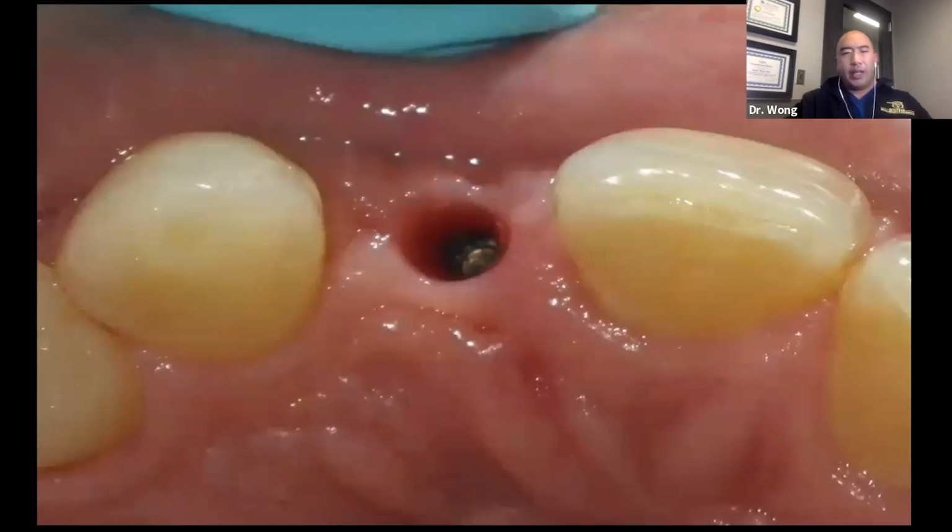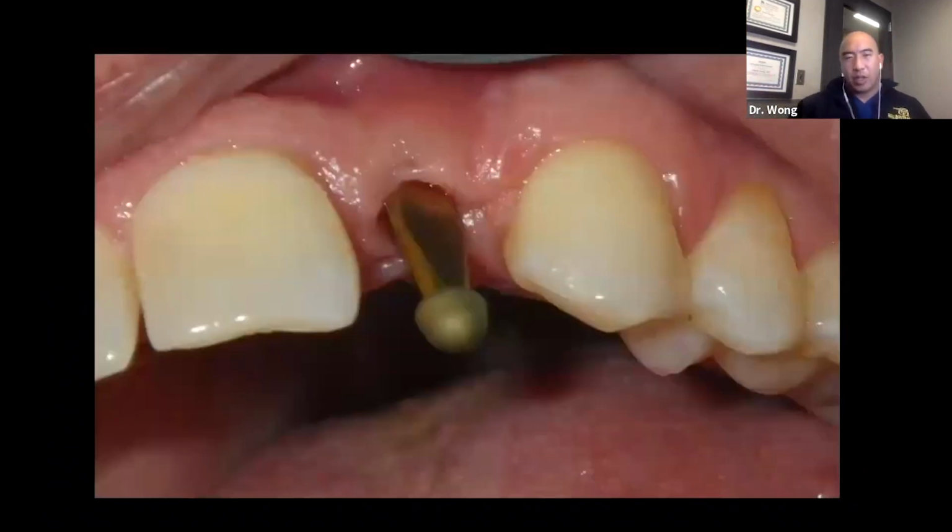We let the implant heal up the appropriate amount of time. Once again, you can either use the torque test, you can use your ISQ, you can do whatever you want to do, but at any rate, we send the patient back to the dentist for the final restoration. As soon as the dentist gets the case back, he takes off the healing abutment, puts an impression coping on, like so. This is what it looks like for virtually every single implant company out there, right? You have a little post with a little knob on the top of it. So impression post goes on.